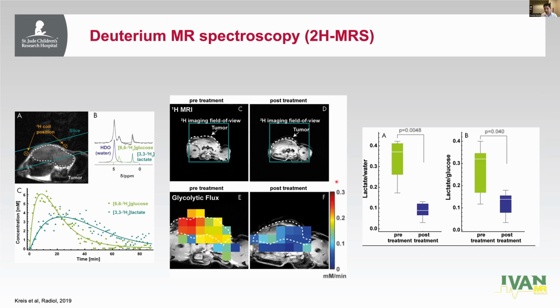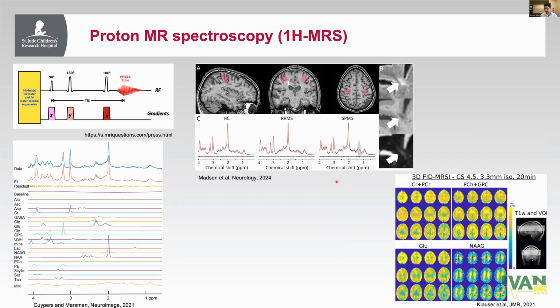Right, but you still require a specialized hardware to capture deuterium signal. So when we were reading those two papers back in 2018, 2019, we thought, why can we not do proton spectroscopy? And I'll talk to you about that in a minute.